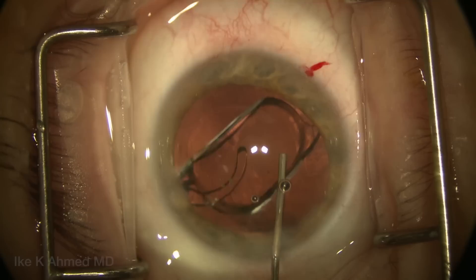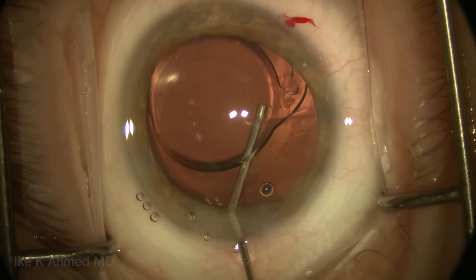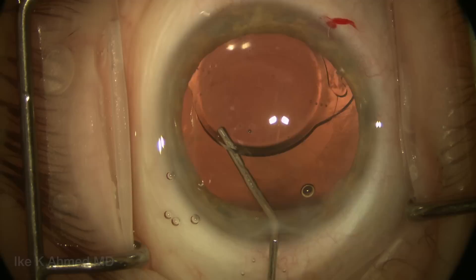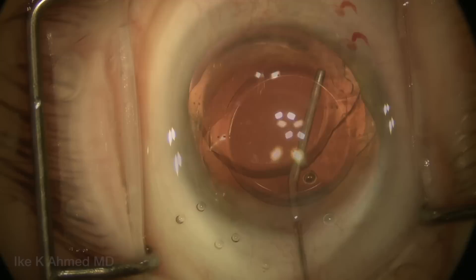A capsular tension ring has been placed in the capsular bag. Because we're going to be doing a pupilloplasty, we're going to remove viscoelastic from behind the IOL manually using a 27-gauge cannula. This is important to do prior to the iris repair, as it may be difficult to access the viscoelastic behind the lens — this ensures the toric lens stays in position to prevent rotation and reduces the likelihood of a post-operative IOP spike.